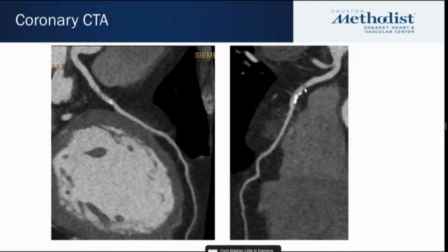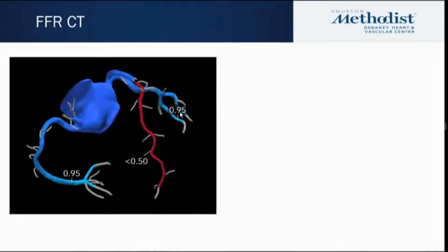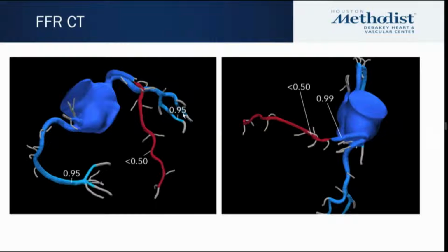So because of this plaque and intermittent chest pain, it was sent to CT-FFR, and these are the images that came back. And it's not a borderline case. This is something that dropped dramatically from 0.99 to less than 0.5. And maybe I'll ask Dr. Mahmarian to comment at this point. What would you do at this time?